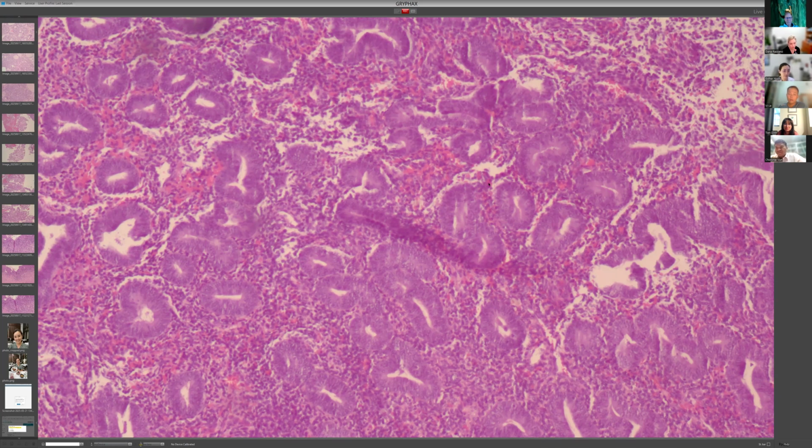So when you have sort of an equal distance and there's room in between, like there are some stromal cells in between the glands, that's okay. But when you start to see most glands don't have stroma in between, like this one, maybe one gland or a fused gland, there's maybe two or three cells, it's back-to-back glands, then you're in a hyperplasia realm.